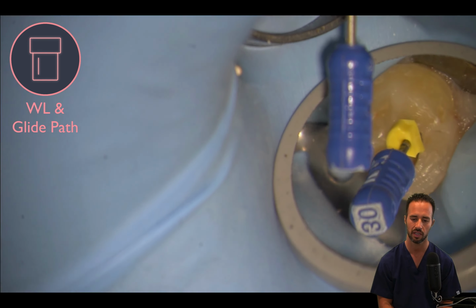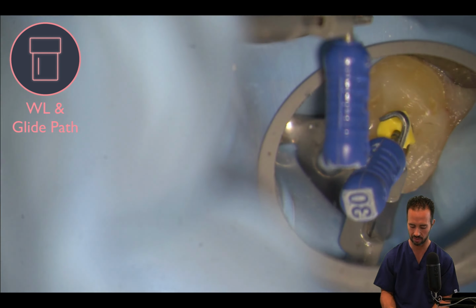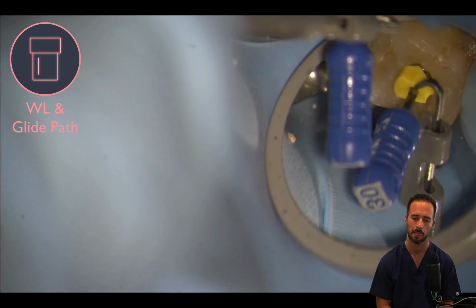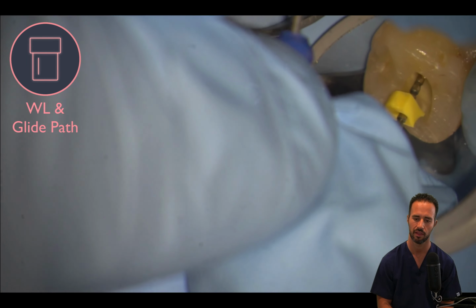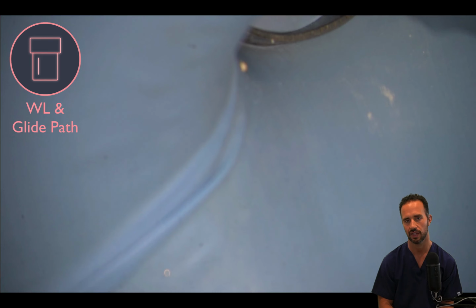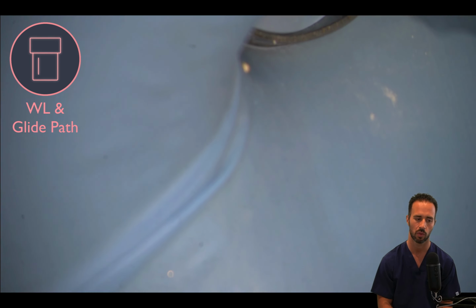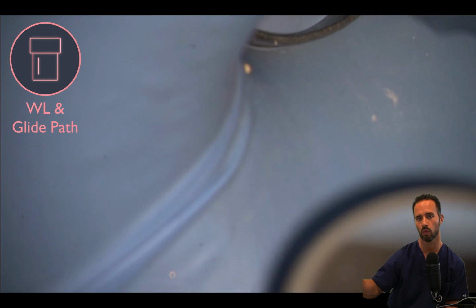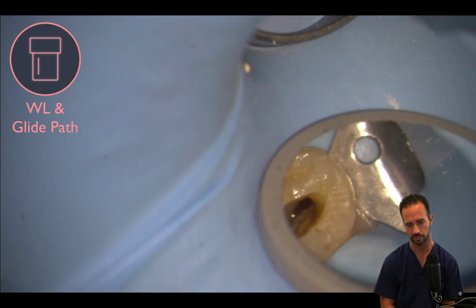I'm determining so far that the working length in the palatal is 18 millimeters. And there we have it. A nice snug hand file all the way down to the apex. And so we're going to use the 30 file eventually to take our working length in the palatal canal.